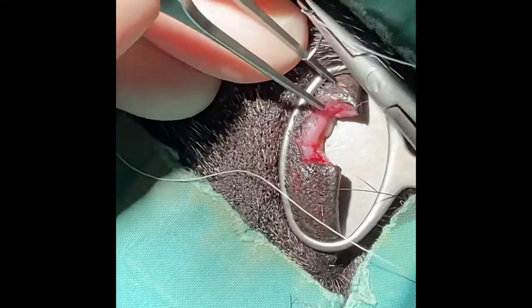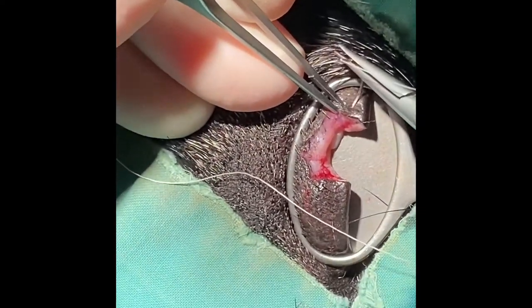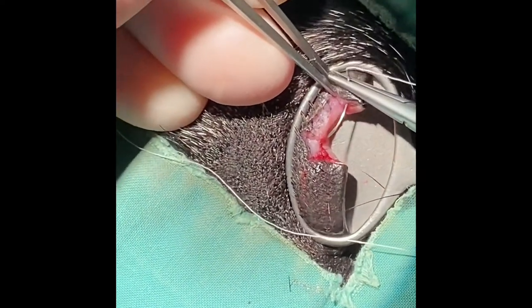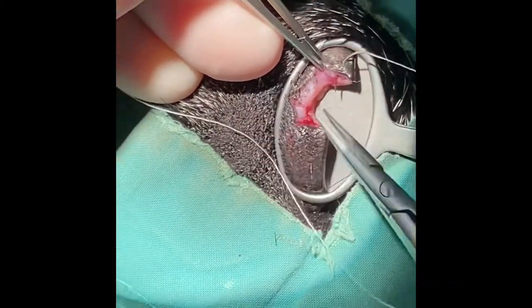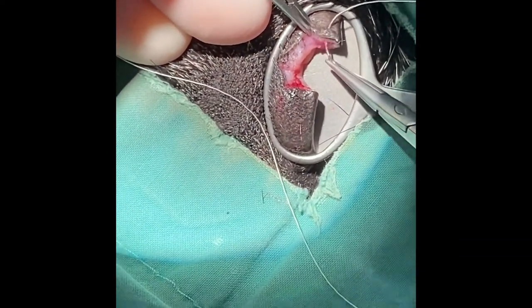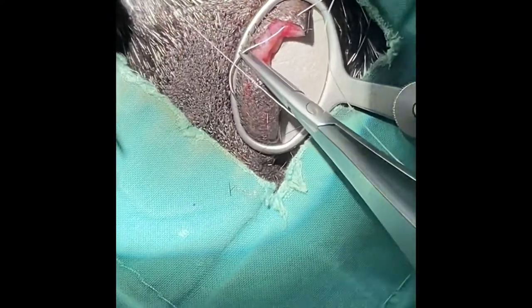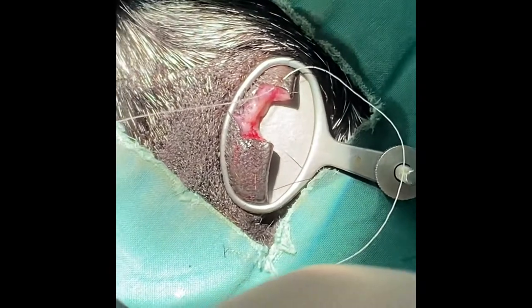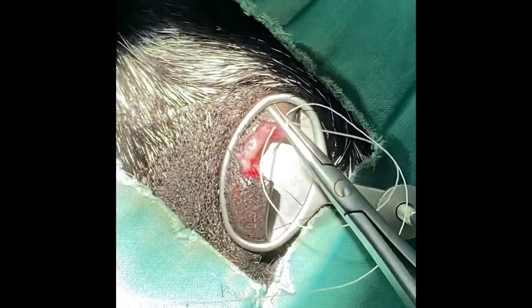Hi there. This video is aiming to show you how to do a figure of eight suture on the eyelid margin, so that the knot is positioned well away from the cornea and to ensure that it isn't irritated at all by your suture.